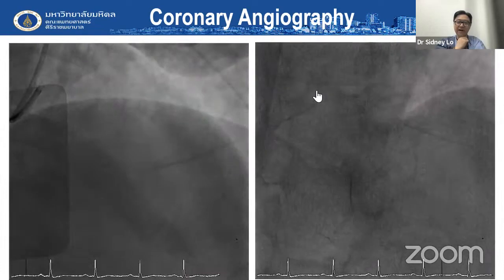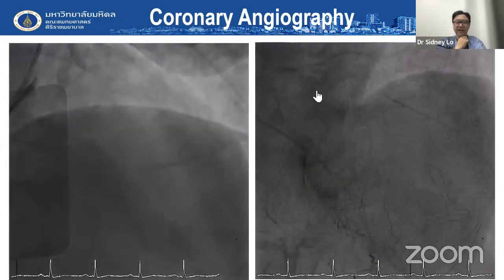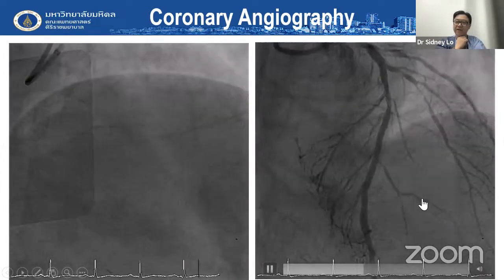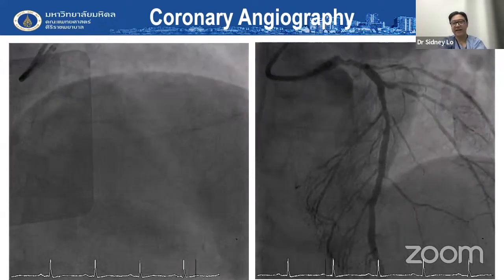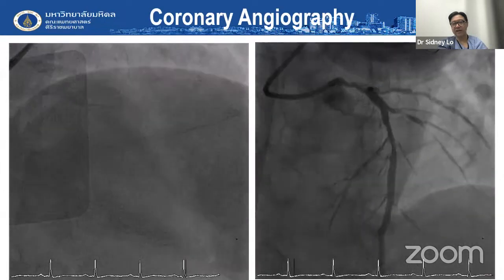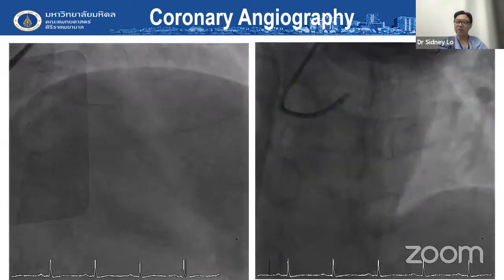So minimizing ischemia time is important, but obviously if he's not particularly frail from any other respect, then it's a bit borderline for mechanical cardiac support. We would discuss this at the heart team. And if it's recommended, then we have it, so we can actually implant an impeller for the procedure. Once an impeller is in, then we would probably complete everything.